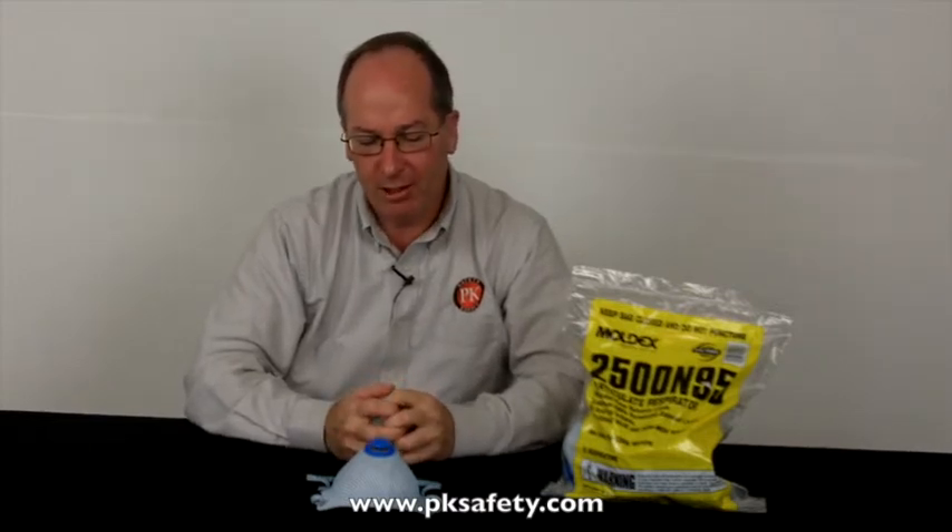Hi, this is Rick Pedley. Welcome to PK Safety. Today we're going to be looking at the Moldex 2500 N95 Disposable Respirator.